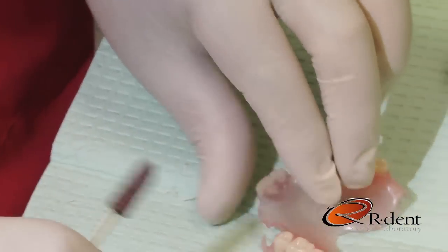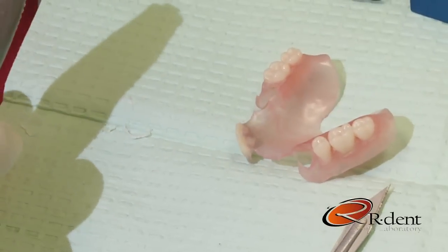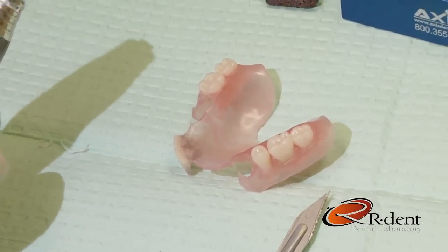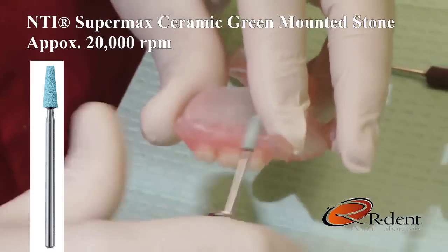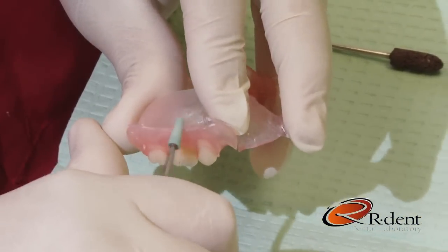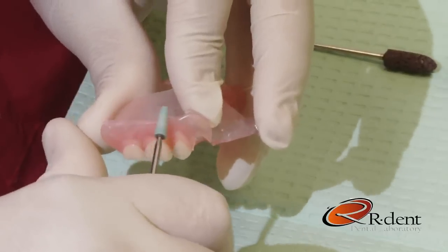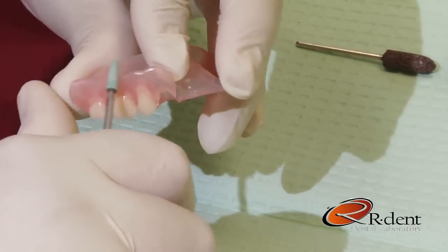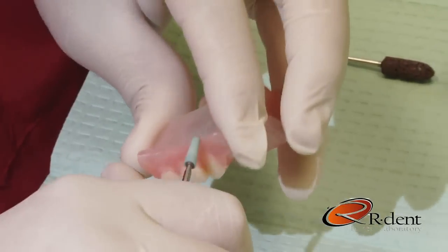Once all adjustments have been made and your periphery borders are at your desired length, we then begin to repolish the partial. First by using the Supermax ceramic green mounted stone. At approximately 20,000 RPMs, I place the stone on the periphery surface of the partial in a left to right motion and slowly begin to smooth the surface.